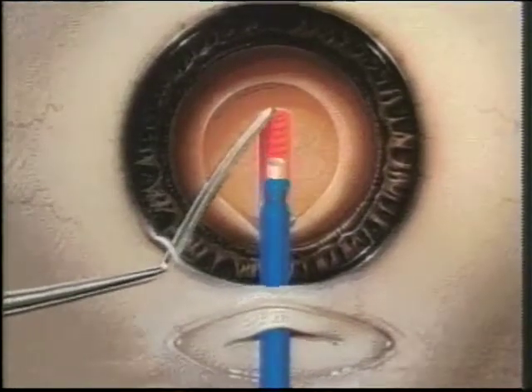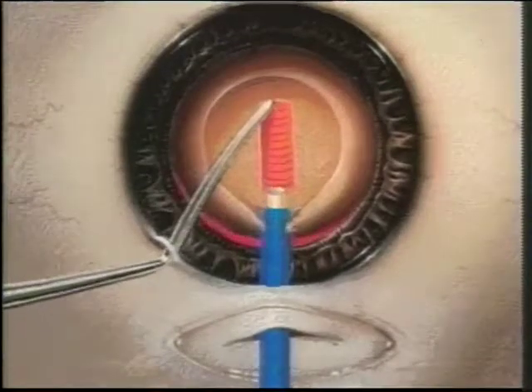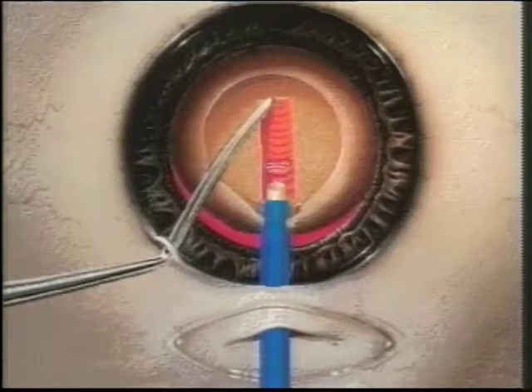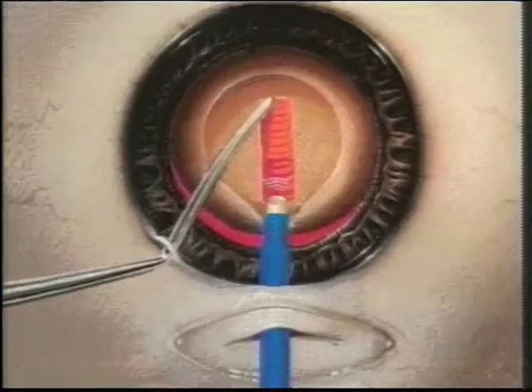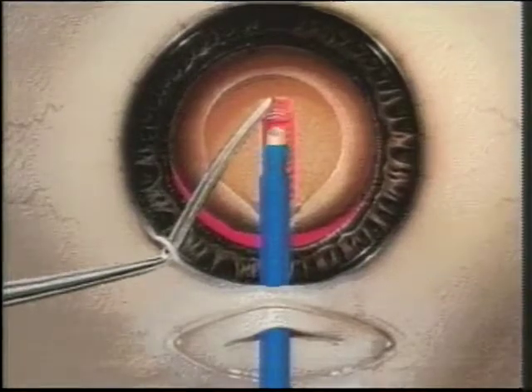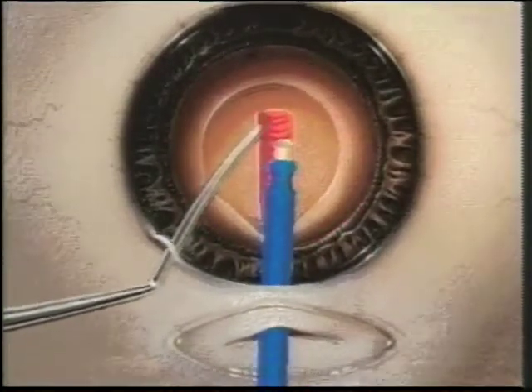By nudging the lens inferiorly with the second instrument, the upper part of the lens nucleus can be sculpted deeply, parallel and close to the posterior capsule. This allows the surgeon to reach the posterior pole of the lens very early for effective fracturing.